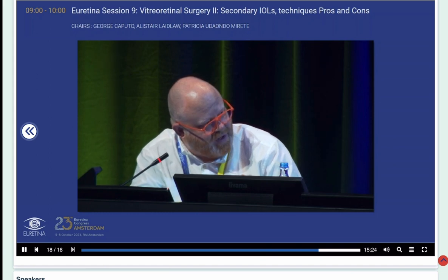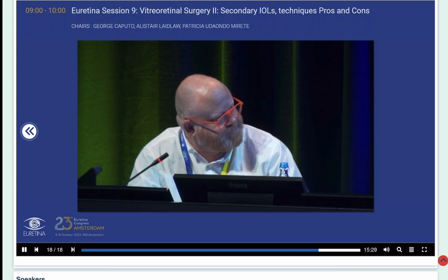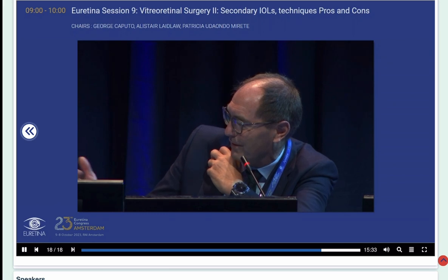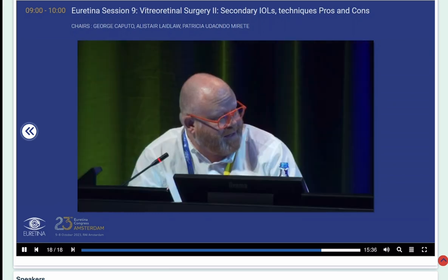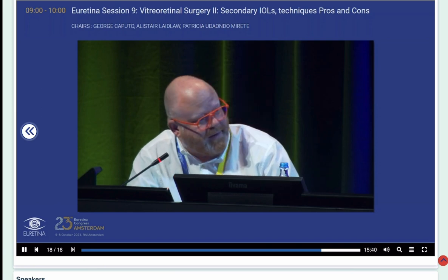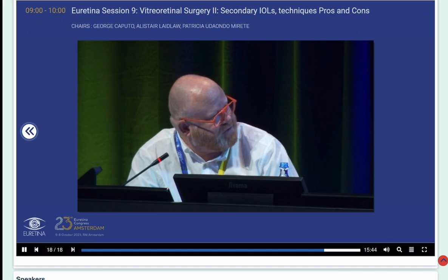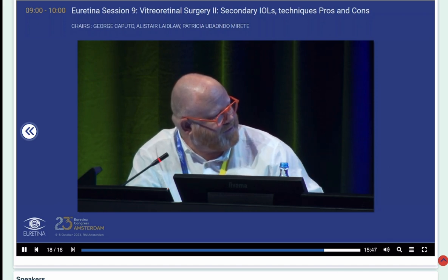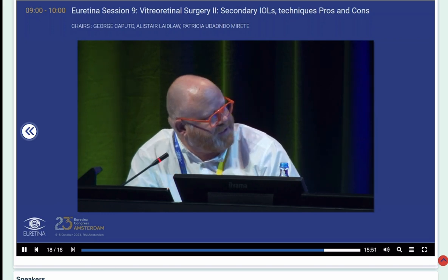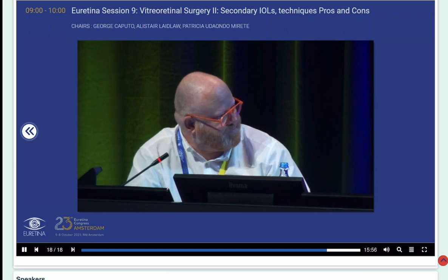Just barely where you actually see it, so you come very close to the plane of the iris, actually. And dealing with iris prolapses with that, if you're near the iris root? Well, I usually do those when I also have my vitrectomy already done, so I switch off my infusion cannula, of course, and at that point you have a very stable, also stabilized anterior chamber with viscoelastic, so there's no flow, so you can just slide it in.